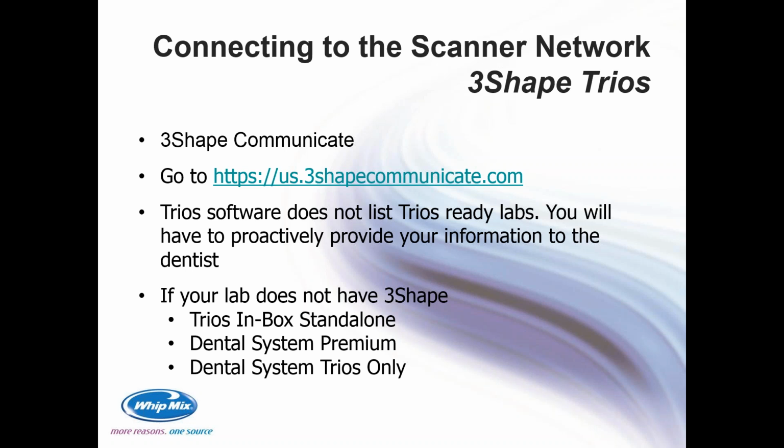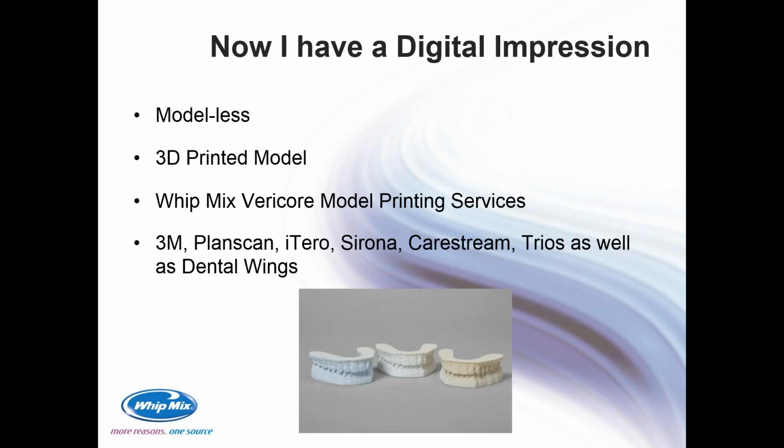So now that you have a digital impression, the doc has sent you a file, and you start to look at what to do from there. You have the option of going straight to your design software and designing the restoration and fabricating it. In other words, modelless. And while I think we may be there someday, and I know some labs are doing it now, the majority of labs that I talk to, probably 99% if not more, still feel more comfortable working with a model.